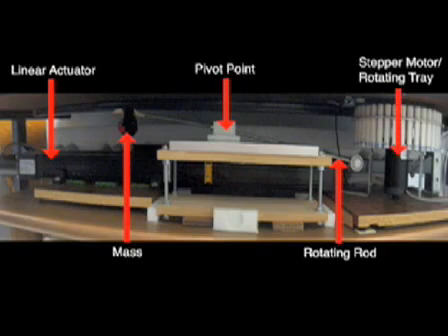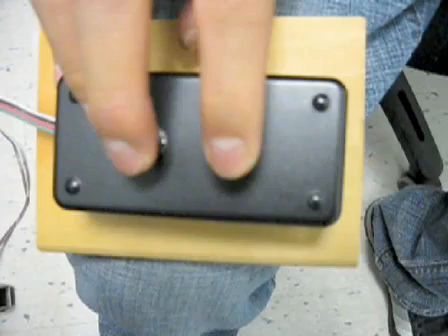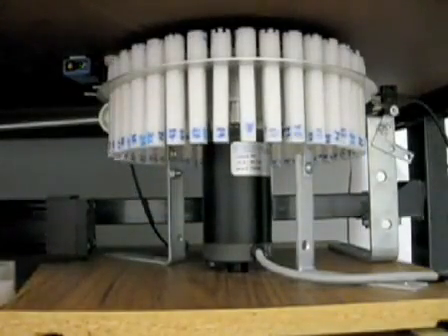A particular piece is positioned directly under a tunnel in the upper table by a computer-controlled stepper motor that spins the stimulus tray. After the subject pushes a response button, the computer commands the stepper motor to rotate the stimulus tray, positioning another stimulus piece directly under the tunnel in the upper table.